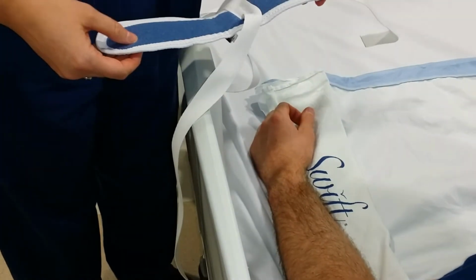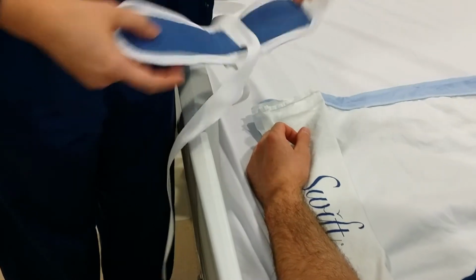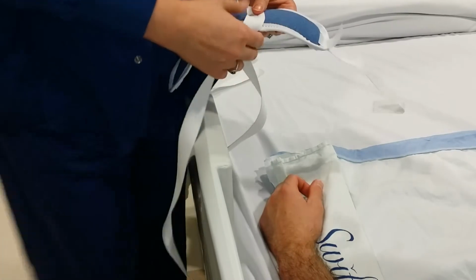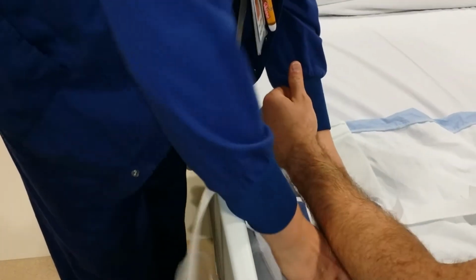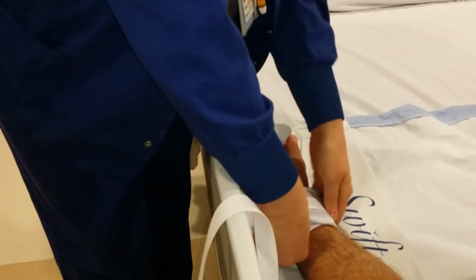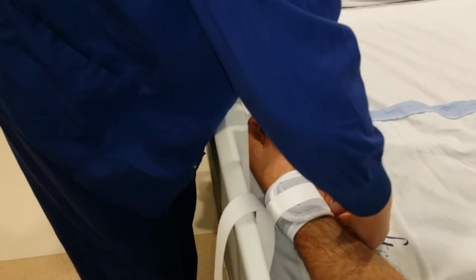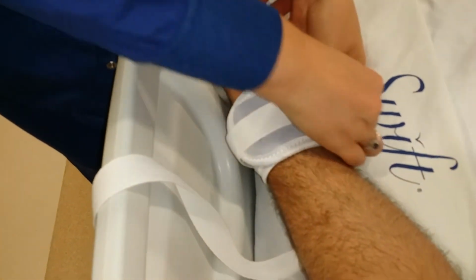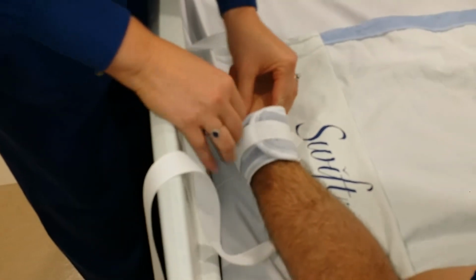Okay. Now we'll talk about proper restraint placement. The actual type of restraint you have may vary based on who orders your supplies, but it's all the same concept. You'll explain to your patient what you're doing, which we've already done, and we put the restraint on the patient and secure it here. When you're applying restraints, you want to make sure that you have 2 finger widths underneath the restraint. So you want to make sure that they have room, and part of your checks are to check their pulse.